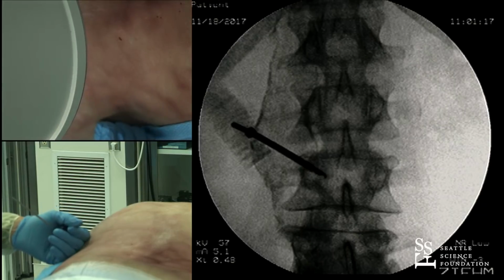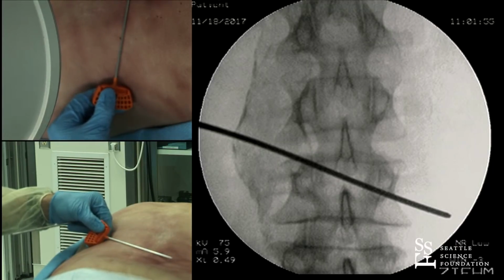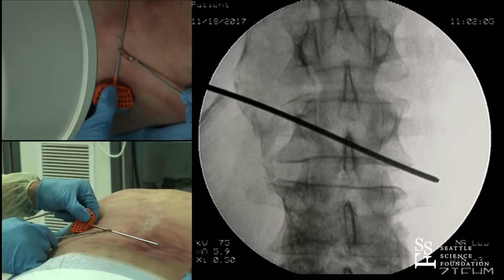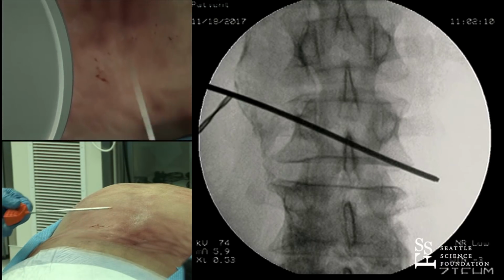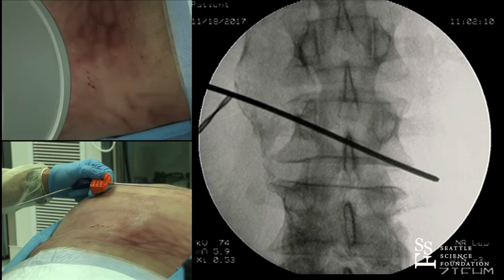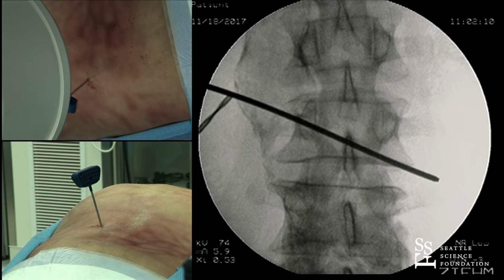So on a line that goes from ipsilateral superior to contralateral inferior vertebral corner, we will go a vertebral body width out. You remember my perpendicular approach, this will put us right about a vertebral body width here. So this is our start point. As you'll see on the back of the cadaver, from the initial incision, it's here, my new incision is here. So the trajectory is just farther out. It's the exact same trajectory as we did on our transpedicular approach, we're just farther out, and that provides exactly the same targeting, 10 o'clock or 2 o'clock.